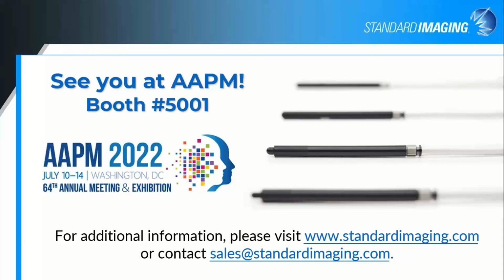A question about advantage and disadvantage of film in small fields. Film calibration is a little bit tricky when you get down to these small fields, primarily because some of the scanners, depending on how they collimate the light, if you have a very small irradiation, so a small dark dot on your radiochromic film, and you're trying to scan that profile, you can get scattered light around the dot, around that region, that can decrease the apparent density of the center of that very small region.